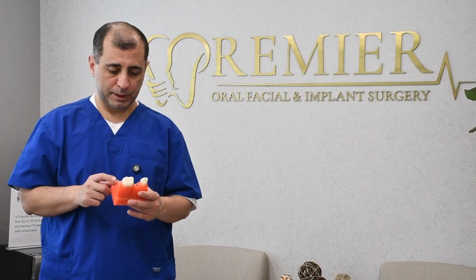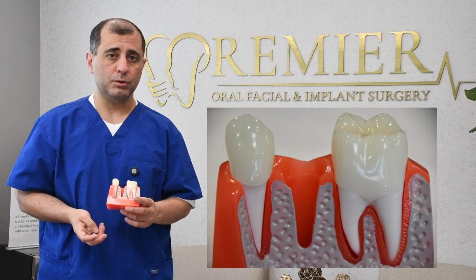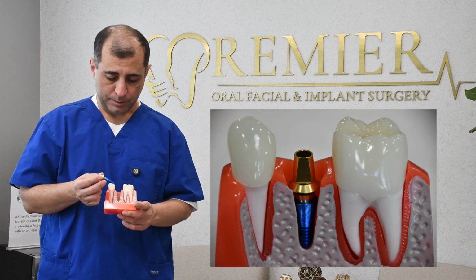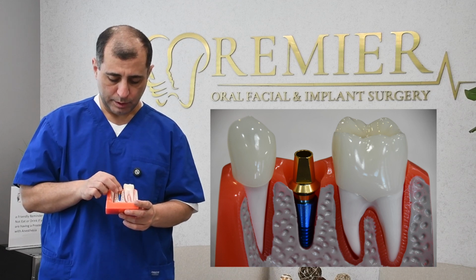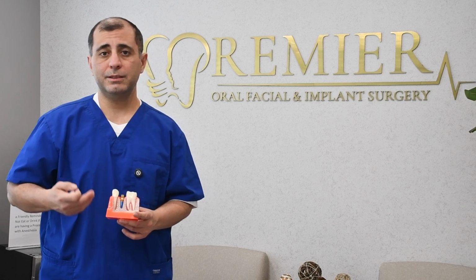So let's say you are missing a tooth, just like you will be seeing in the picture here, and you want to restore that tooth. You want to replace that tooth. So then what we will end up doing is putting a titanium alloy implant that goes where that missing tooth is, and we let it heal for a sufficient period of time. After that implant heals, we come back and expose your implant and then send you back to your dentist.